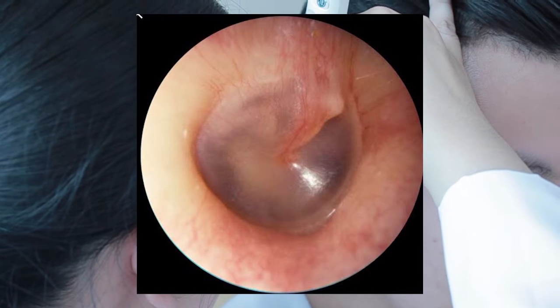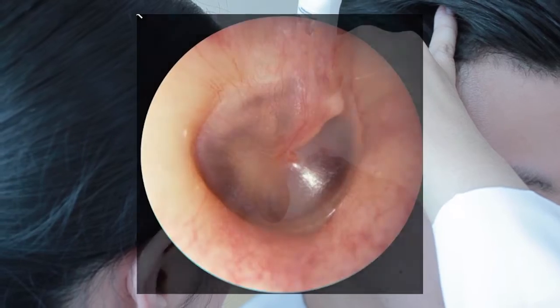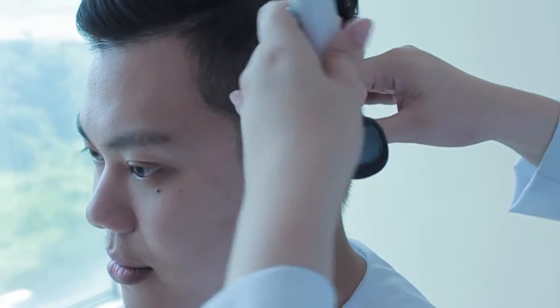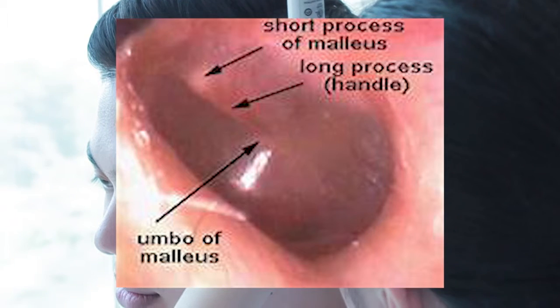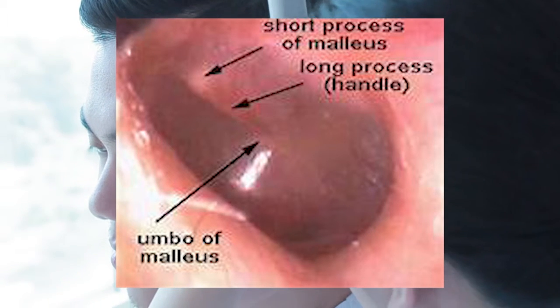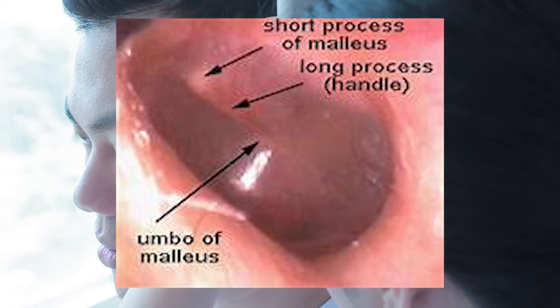The most prominent anatomic feature of the tympanic membrane is the handle of the malleus, which sits in the tympanic membrane and is somewhat anterior in position at its distal end. Extending from the distal end of the malleus, also known as the umbo, is the light reflex. This will help orient towards the anterior-inferior aspect of the tympanic membrane.